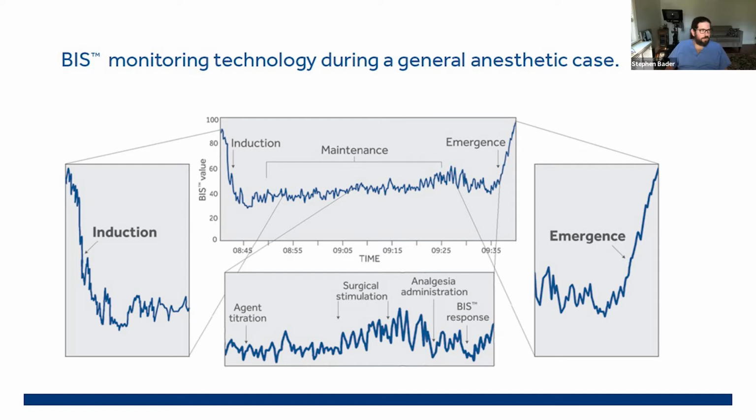As I mentioned, sometimes during a 3-hour procedure, everything's sort of the same. We're getting a little distracted or bored, but you happen to notice that your BIS number has been trending up or trending down, or that there's a sudden change in it, and it forces you to reevaluate the situation. Why did I just suddenly have my BIS jump up or start going down? Did I do something to correlate with that? So it's a helpful way to keep us engaged in the anesthetic and to give you an additional piece of information beyond our traditional parameters.